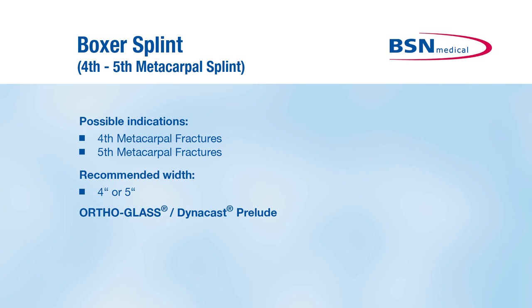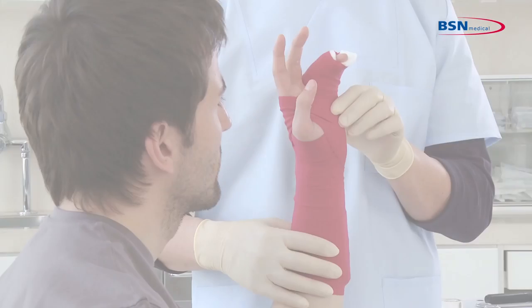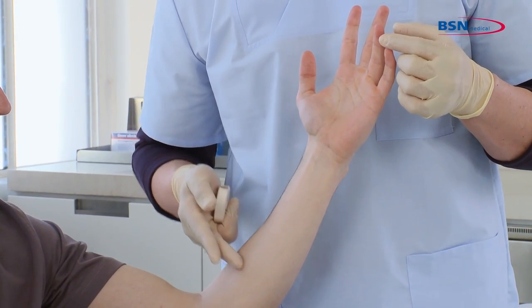The boxer splint is designed to immobilize fourth and/or fifth metacarpal fractures. To begin, measure from the tip of the fourth finger to one hand width distal to the antecubital.